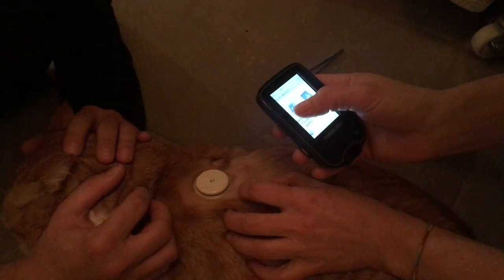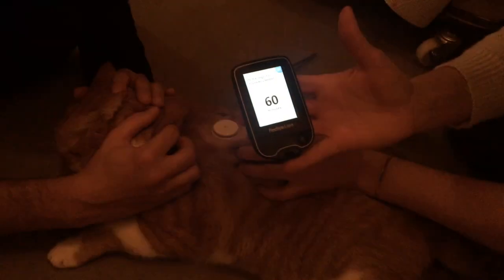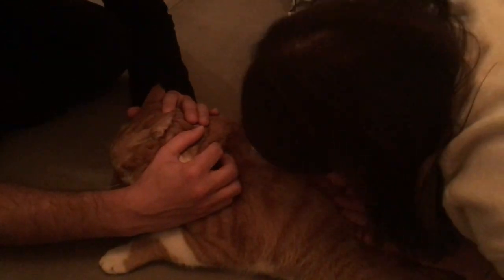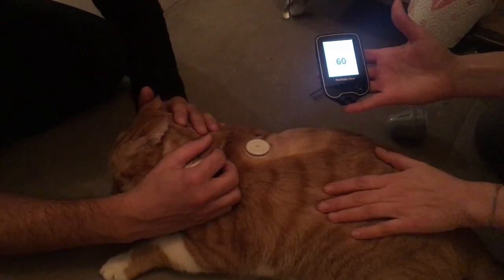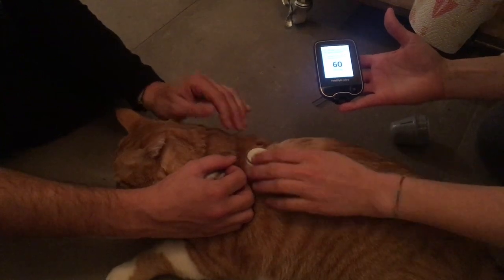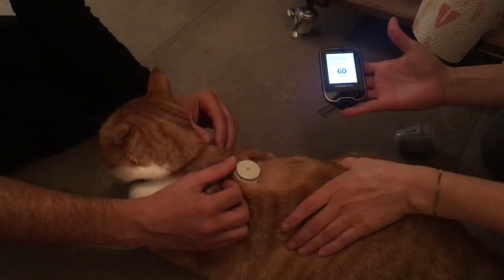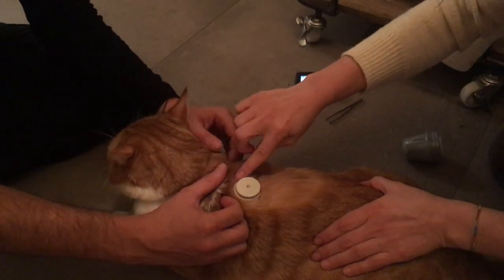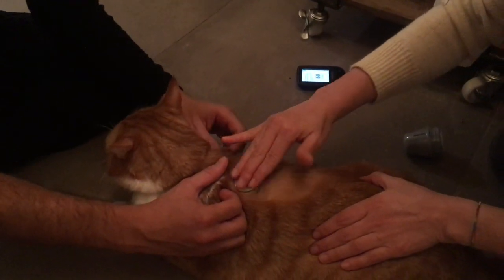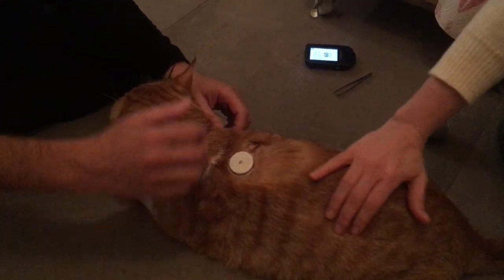We're going to scan a new sensor. In one hour, we get our first reading. And then the sensor takes a reading every 15 minutes automatically. It stores up to eight hours of measurements, so if you scan every eight hours, you have a complete 24/7 record of the glucose.